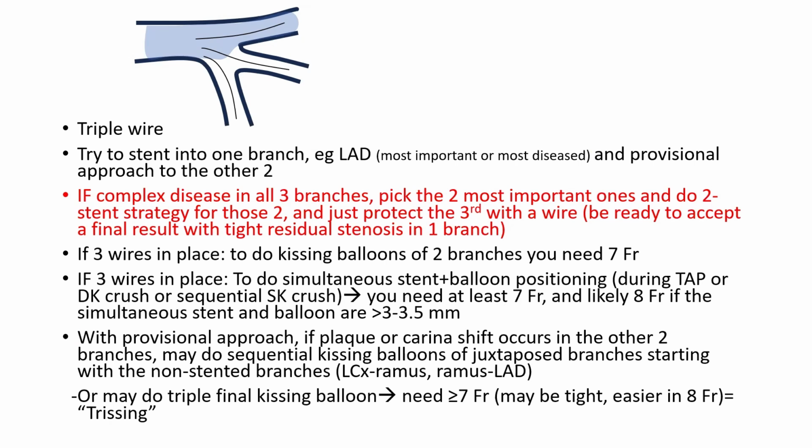You can do 6 French if you have double wires and your stent balloon are less than 3.5 millimeters, but you need at least 7 French if you have triple wires. And you need likely 8 French if your simultaneous stent and balloon are over 3 to 3.5 millimeters.